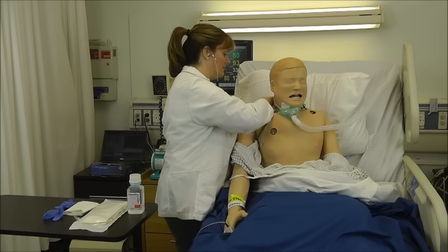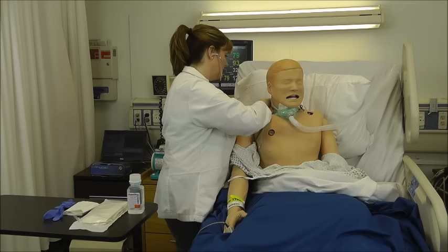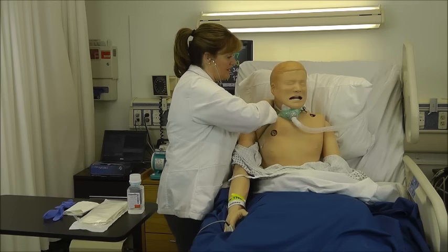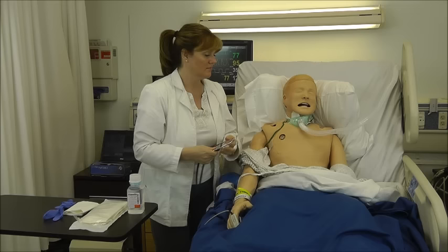Take a deep breath for me, in and out. Again. And one more. Thank you. I hear secretions that are moving in his upper airway that I think we can remove with the suctioning.